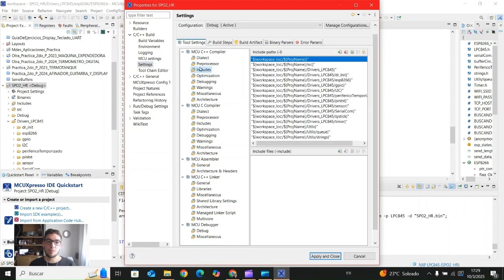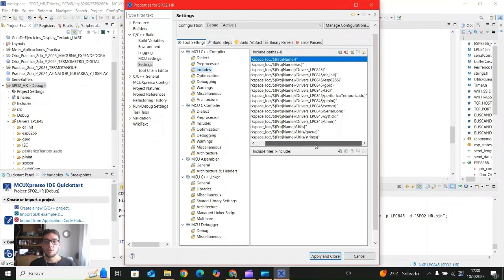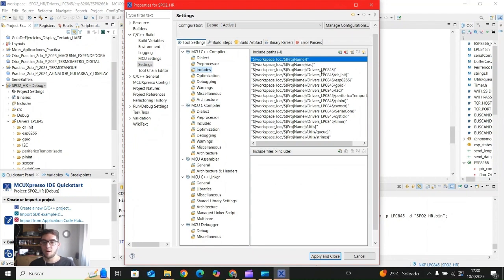So we would go to includes, and we see here the include paths. Okay, the include paths. You can see here the different folder names and everything that the program is going to look for when including libraries or something. When you are doing a project at the beginning, it is very tedious to do it because you need to remember to do this every single time and for every single folder. When importing a project like this, you are going to have everything already set up for you.